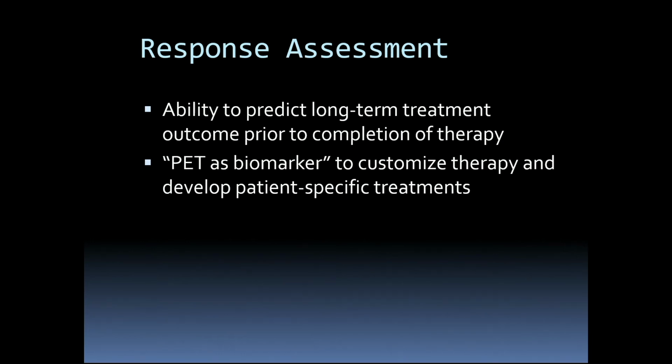You'd like to be able to decide within a fairly short period of time whether a particular intervention, a course of therapy, is going to be effective down the road. And if it is, you can continue on that therapy. If it's not going to be effective and you can demonstrate that very early on, you could switch them to another therapy before wasting weeks to months on something that ultimately may prove to be ineffective.